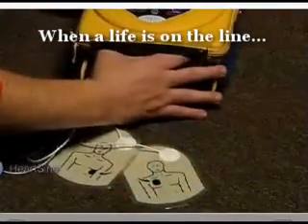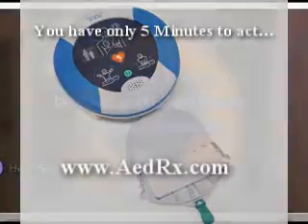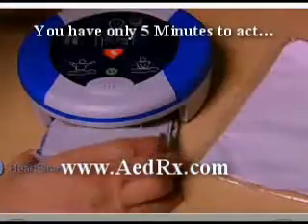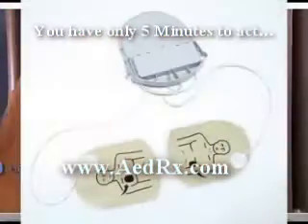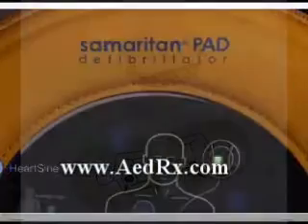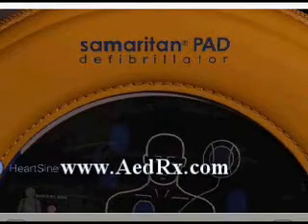After using the Samaritan PAD, remove the used pad pack and follow your local battery disposal guidelines. Slide a new pad pack into the unit and store it as usual. Periodically check that the green light is flashing so you know that the unit is ready in case of an emergency.